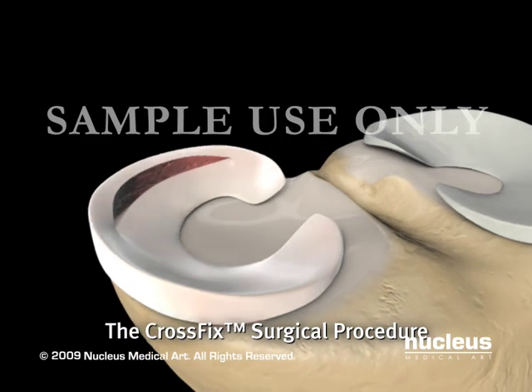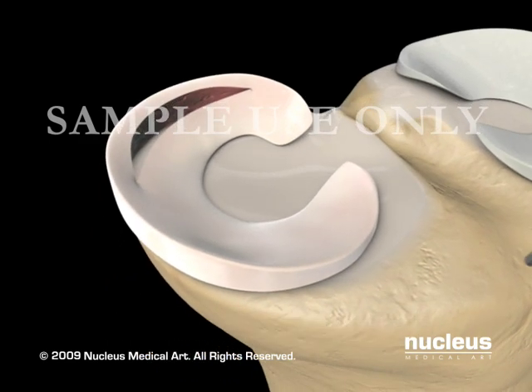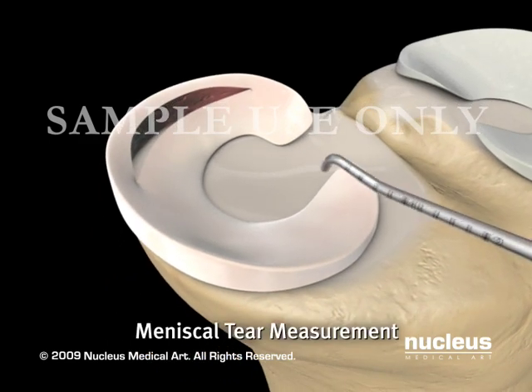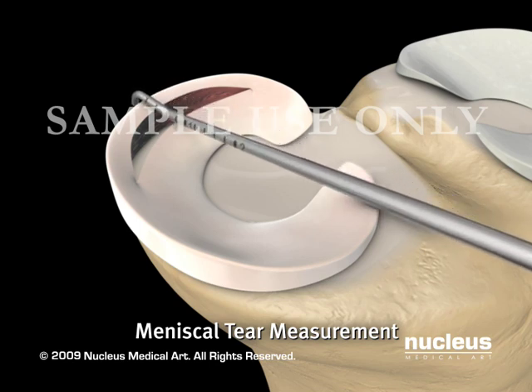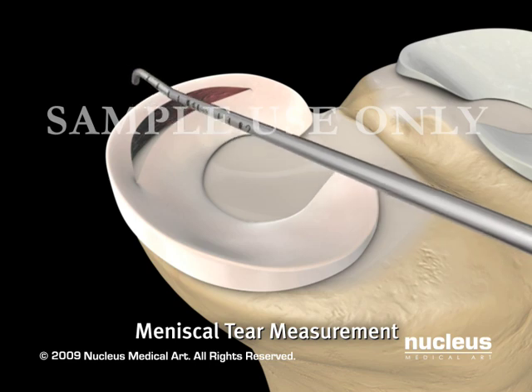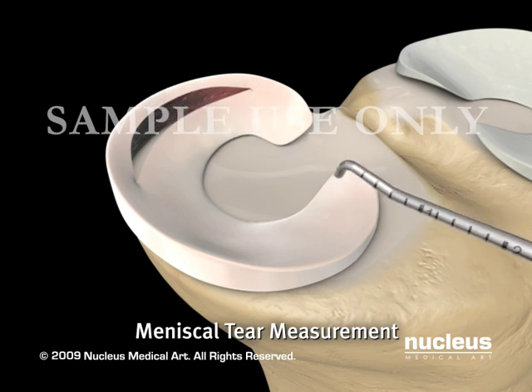The procedure begins with assessing the tear and determining its repairability. After portal placement is determined, the probe is introduced to measure the distance from the capsule to the preferred entry point on the meniscus. This distance will be used for the depth limiter configuration.